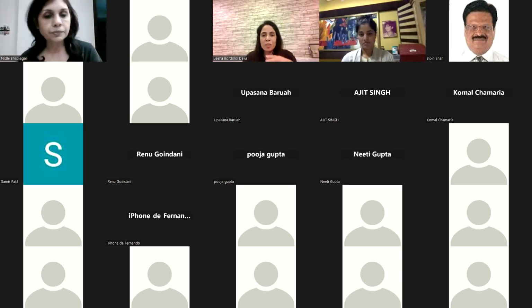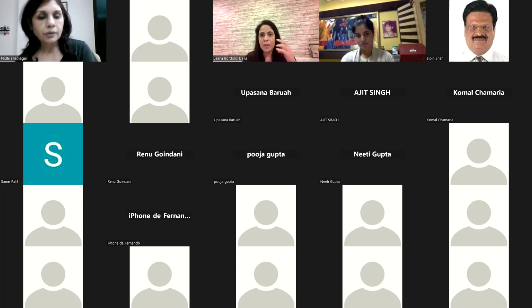So you didn't find it, or is it that you thought we had such diagnostic elements sitting there? No, ma'am. I had mentioned looking at the vascularity and the cystic areas. There, I have said that vascularity is more seen in schwannomas, especially in long-standing ancient schwannomas. And neurofibromas, on the other hand, are more hypovascular. So when we see more vascularity, it goes more towards schwannomas.